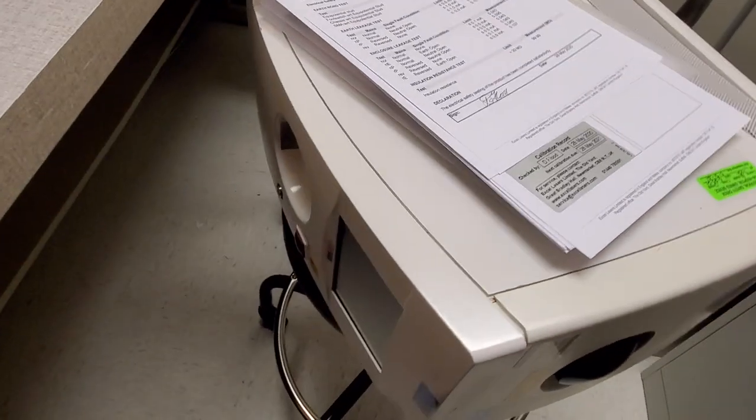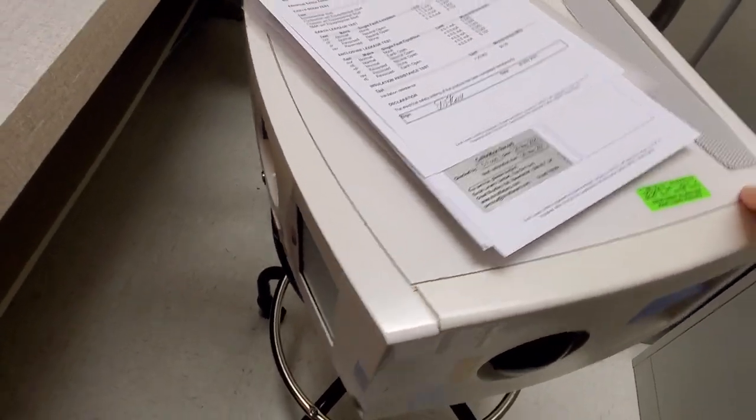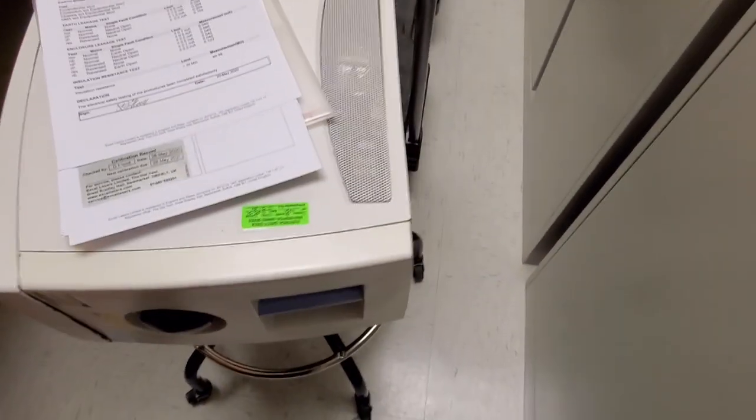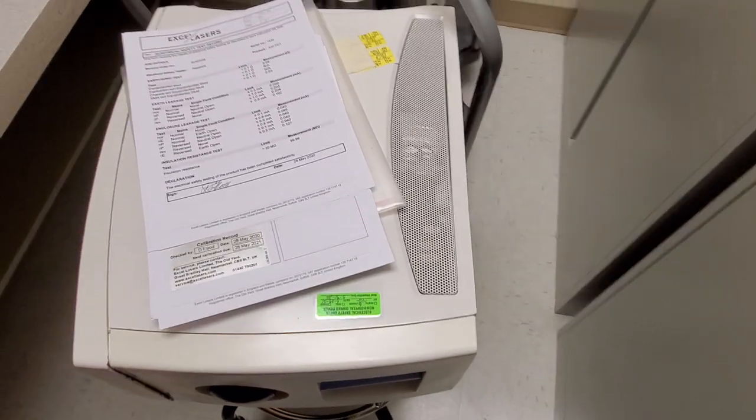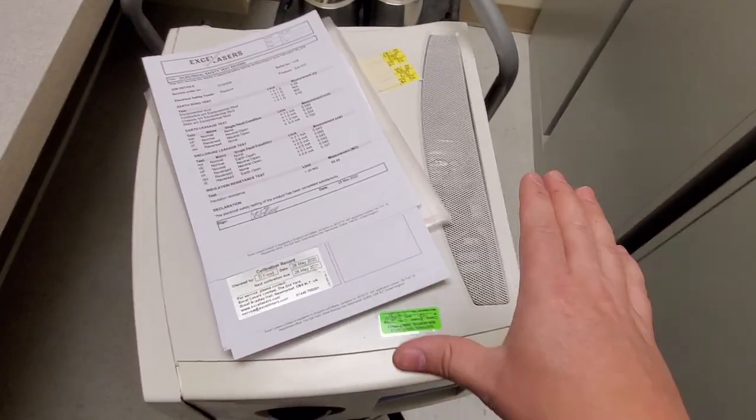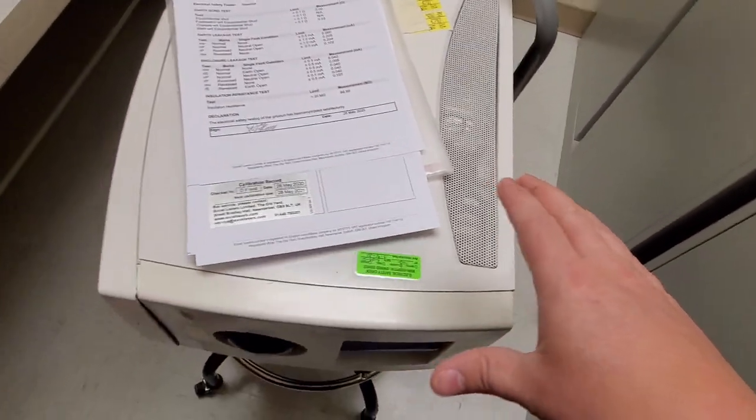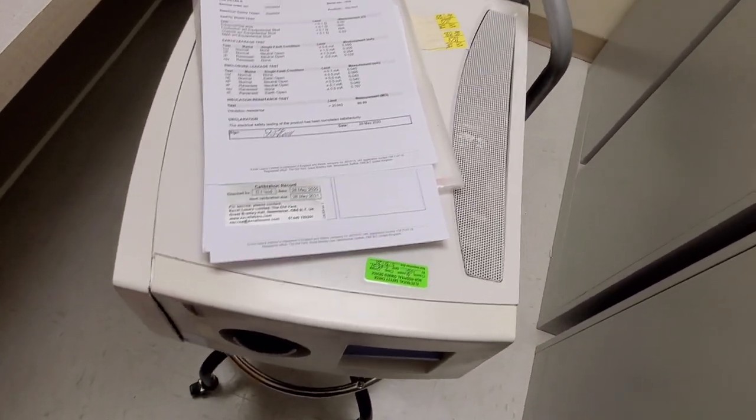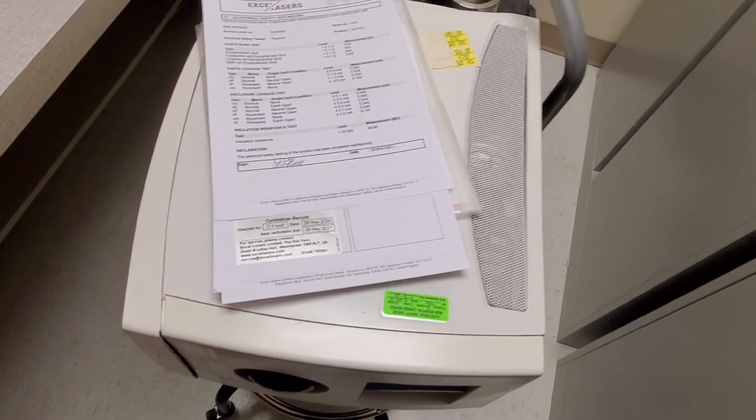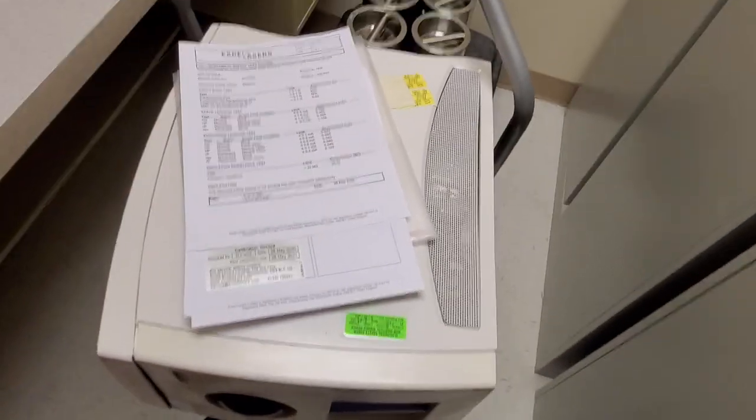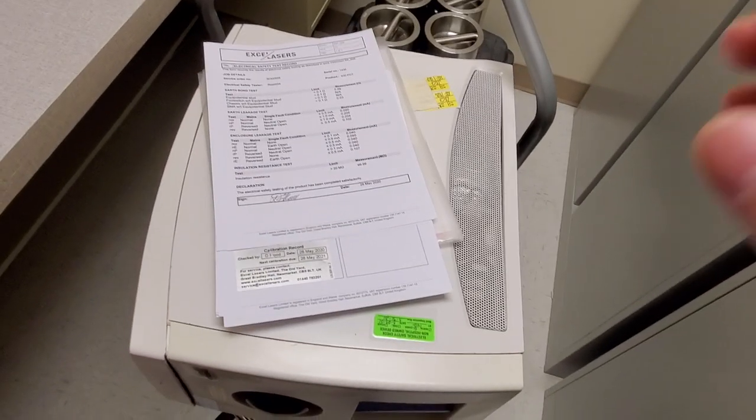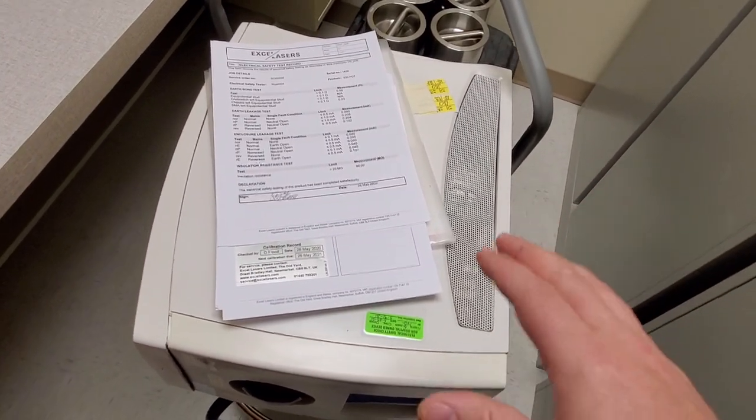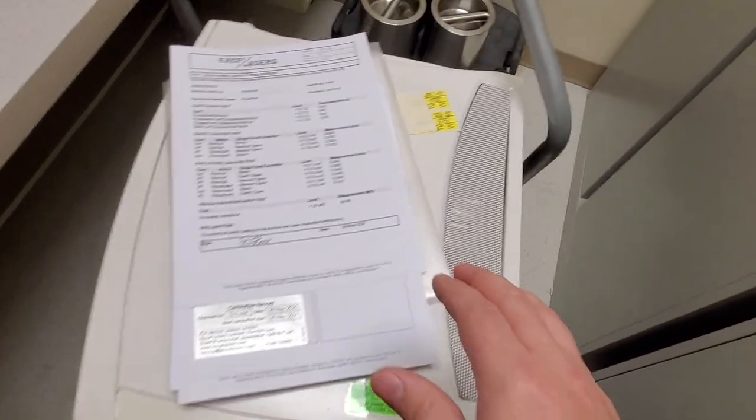Alright, so what I have here is a laser. It's a demo unit that's on loan to us. And it's already had its electrical safety inspection that I just did outside this door. But I want you guys to realize that there's a couple of things that you have to keep an eye out for.